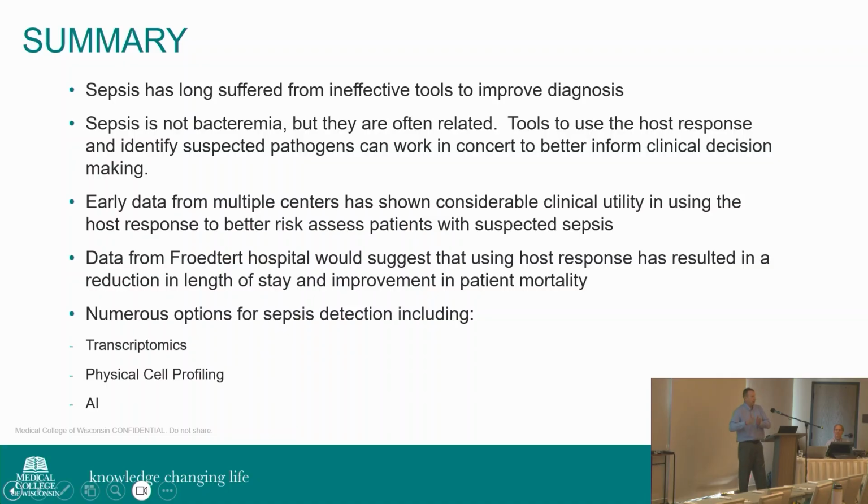By contrast, the MDW test can be done on a hematology analyzer. So if you use Beckman hematology, MDW may be an option that you want to think about. If you want something that's closer to being CLIA waived, something like Triverity may be something you want to look at, because that can really be done by anybody, because there's no manipulation required. It goes on the instrument, does everything, and when it's done, you throw away the cartridge. So it's a really important workflow consideration in terms of what your location is, what you can support, what your volume is, and which test I'm going to choose.